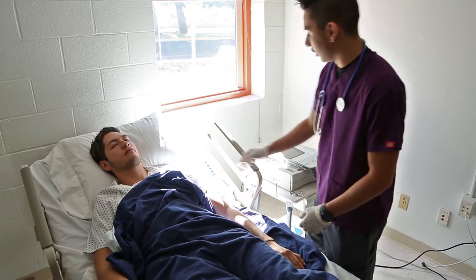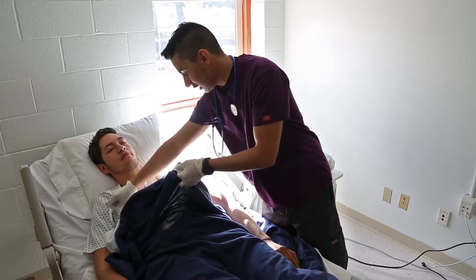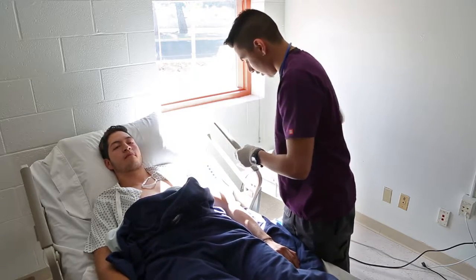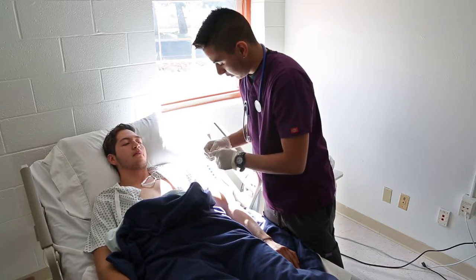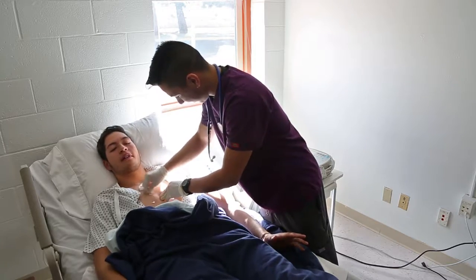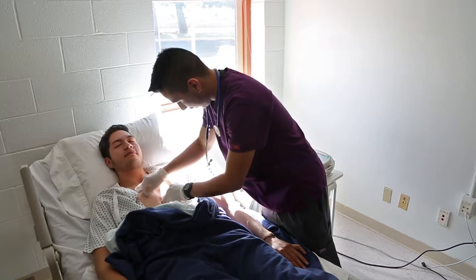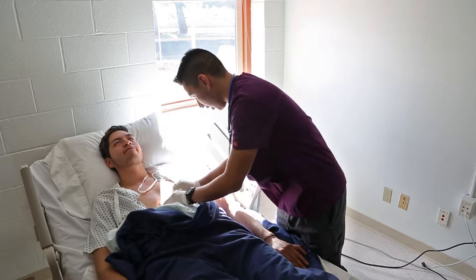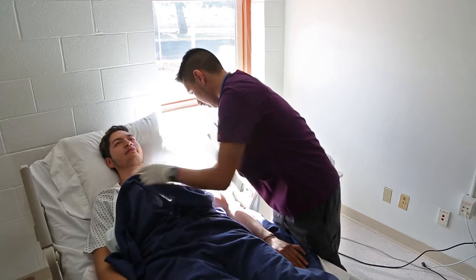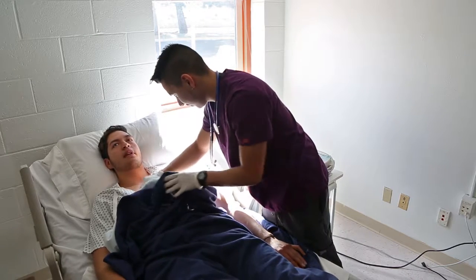We'll go ahead and get started with the procedure. We want to make sure we clean our patient with alcohol to prep the area. We're going to be uncovering the chest — make sure you keep your patient covered at all times. Sir, this might feel a little bit cold — I'm just cleaning the area before we place the electrodes. You want to clean from the fourth intercostal space all the way to the sixth intercostal space. Make sure you keep your patient covered at all times. You doing okay, sir? Yeah, I'm fine.